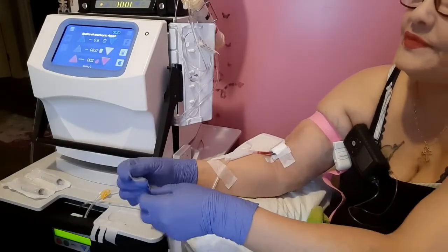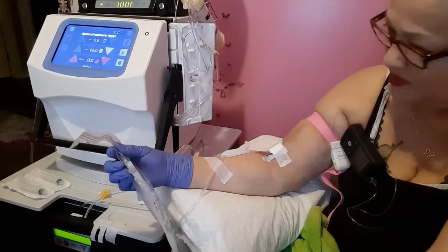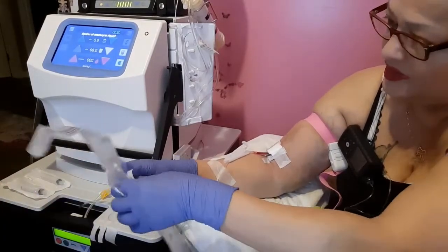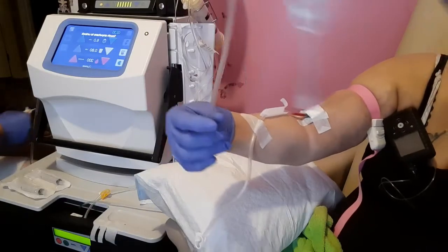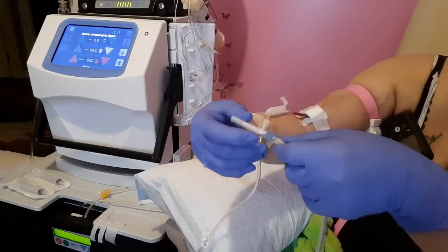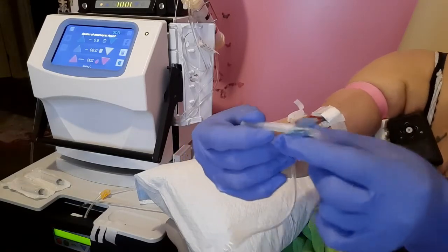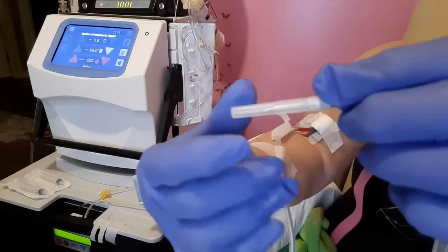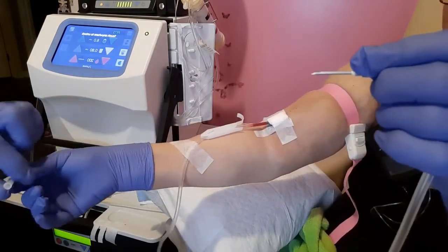Yep. So, take that syringe out. Again, find the smooth side. Okay. Pinch the wings together. Just like so. Hold it straight across. Pull it straight across. Okay.